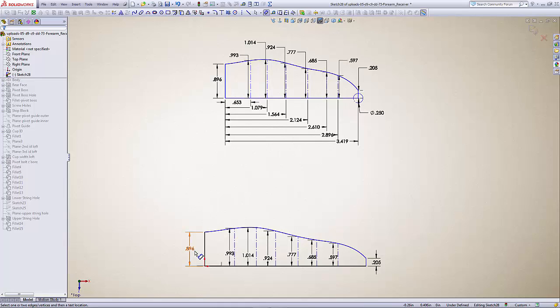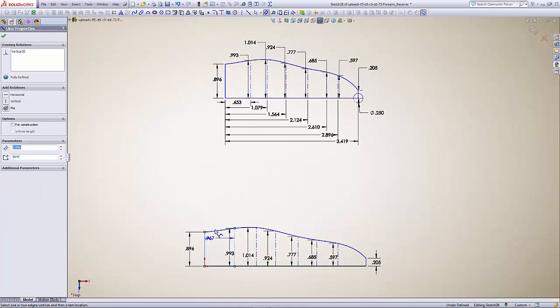Going through all the dimensions: 0.896 matches, 0.993 matches, 1.014, 0.924, 0.777, 0.685, 0.597, 0.205. Now we'll go through and set our length dimensions.